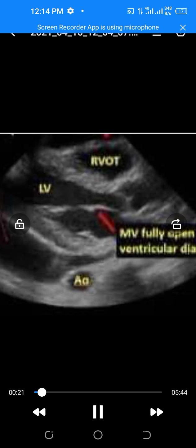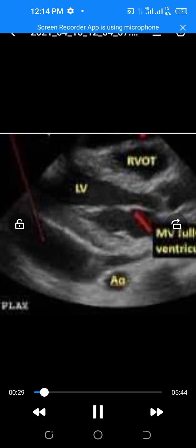And in this video, I'm going to explain how to differentiate between a pericardial and a pleural effusion in the parasternal long axis view.